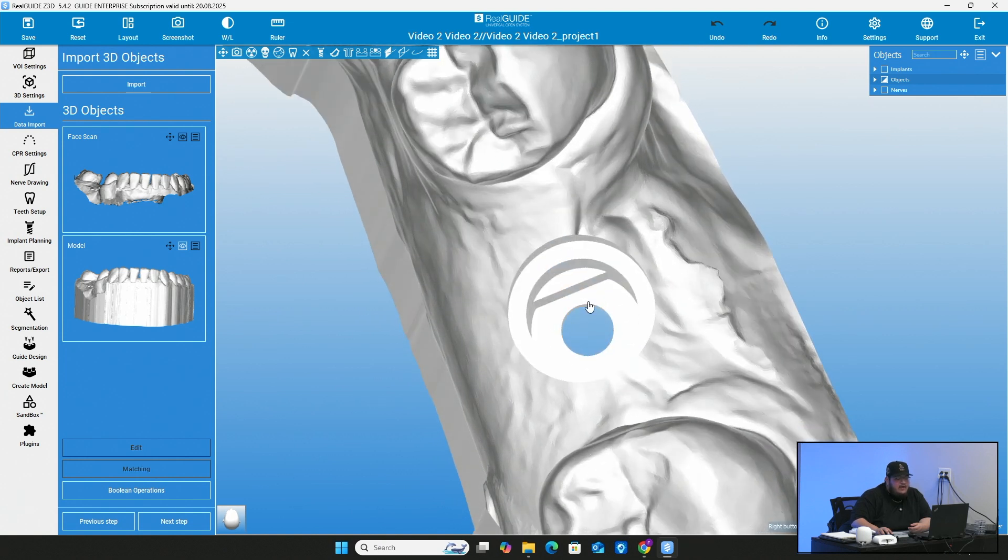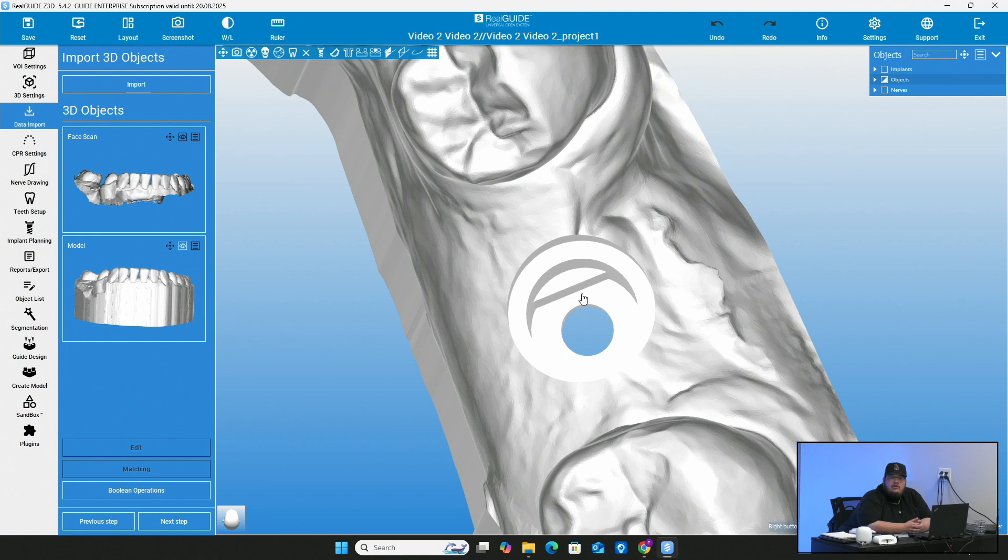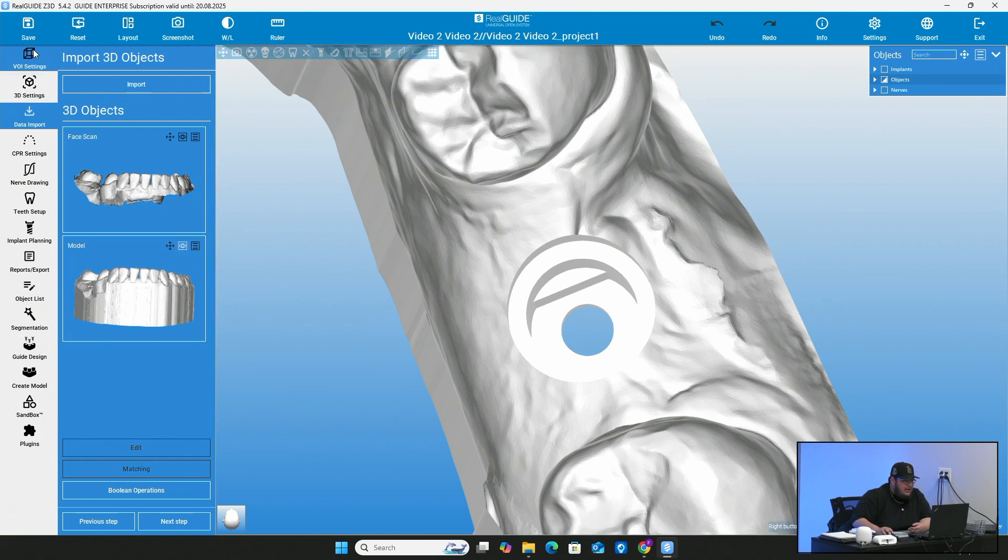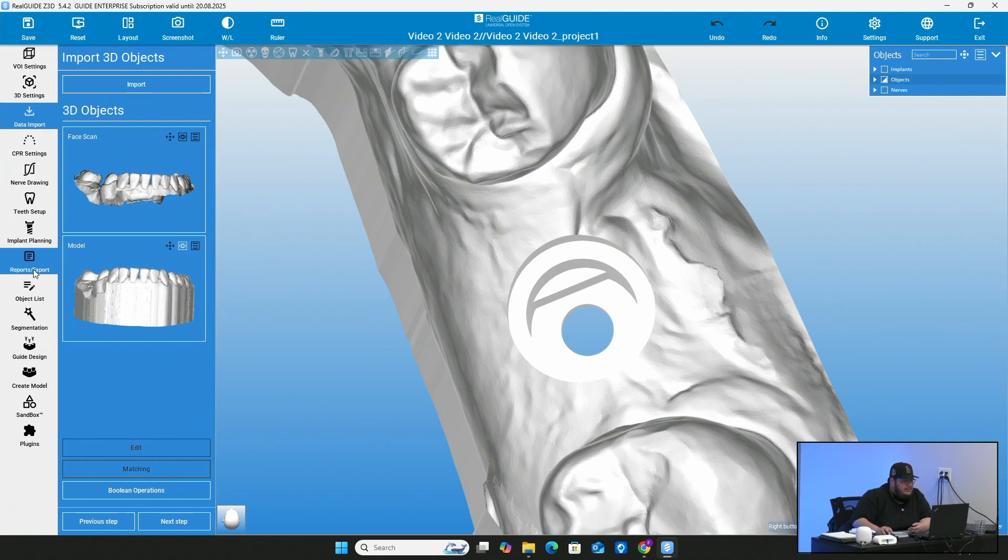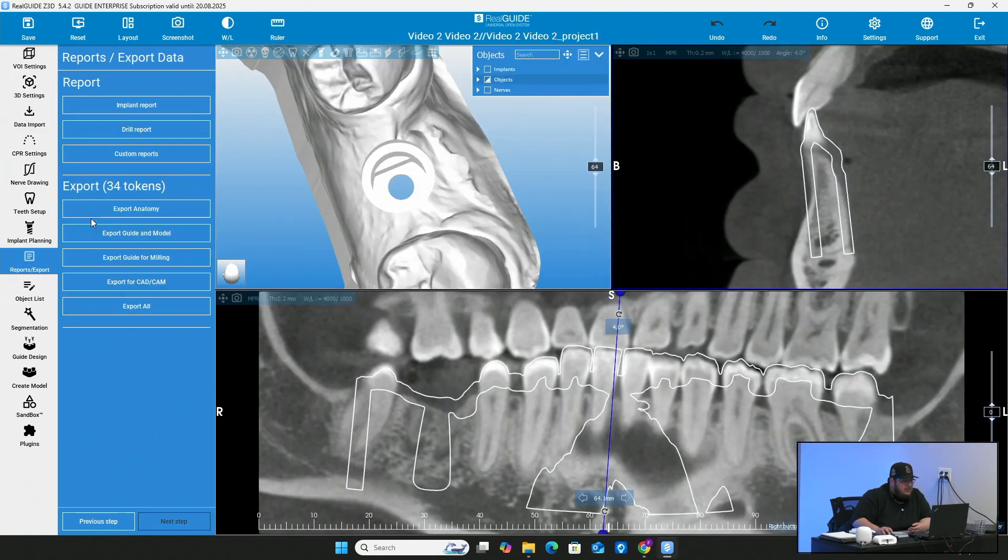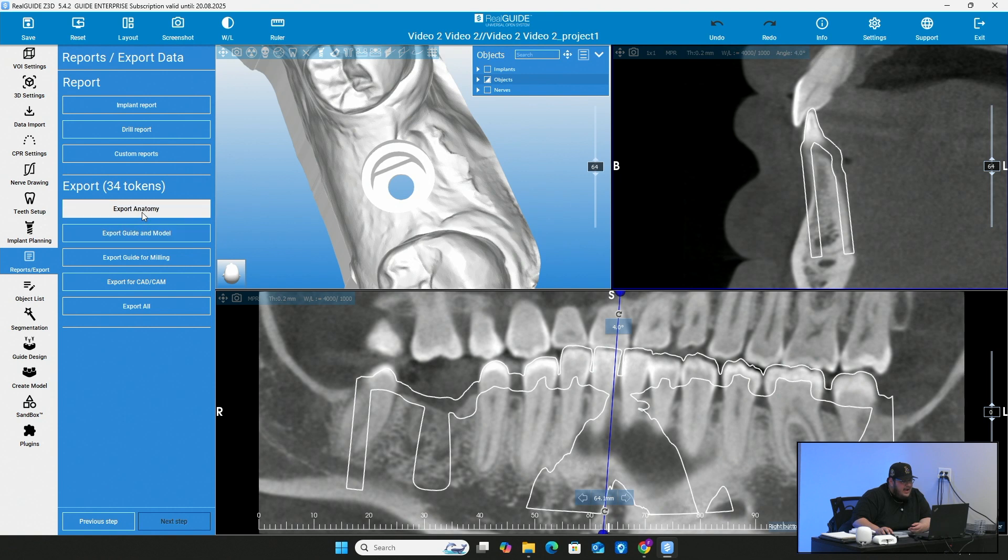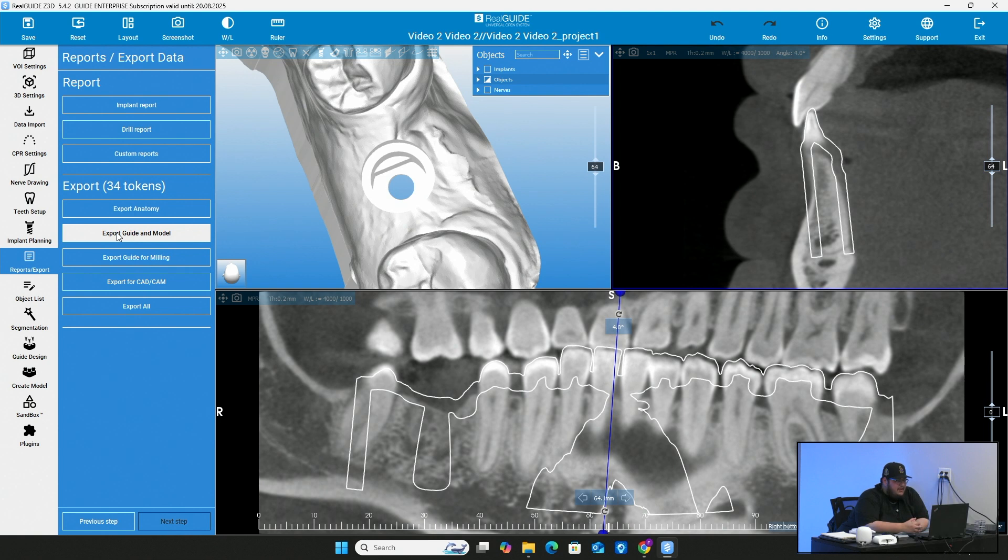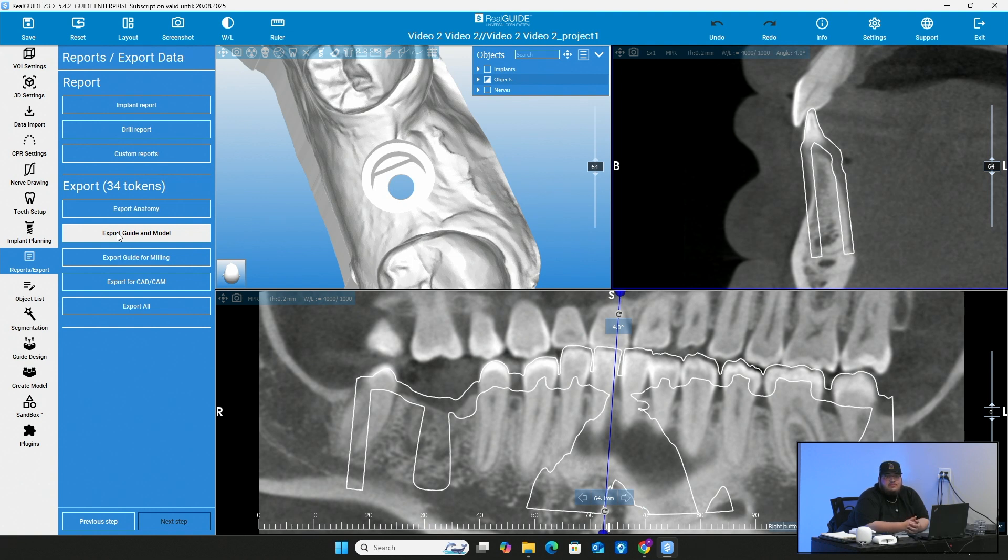And now if I go ahead and go to bio horizon, they do sell these analogs for you. You can go ahead and purchase them and then they should fit right into this model. If you want to extract this model from here, you're just going to go right here to reports and export. And now any model that you made, it says export guide and model. You can export guide and model, find the directory in which you want to export it to, and then you can take it to any printer that you have as an STL and print it out.